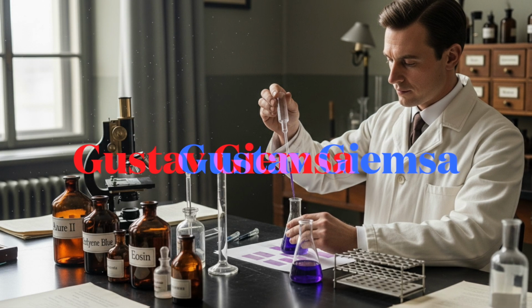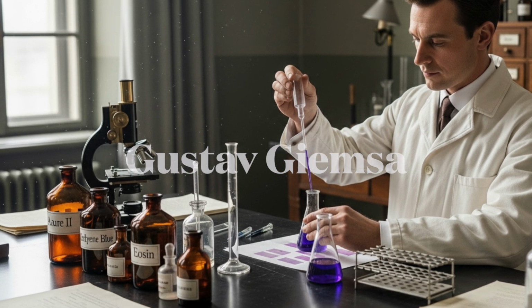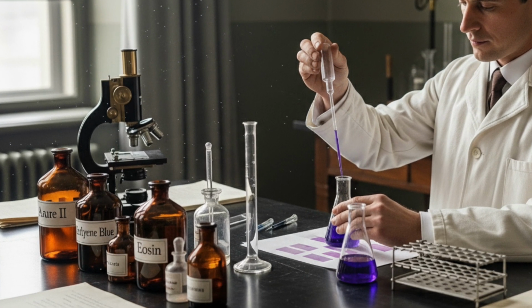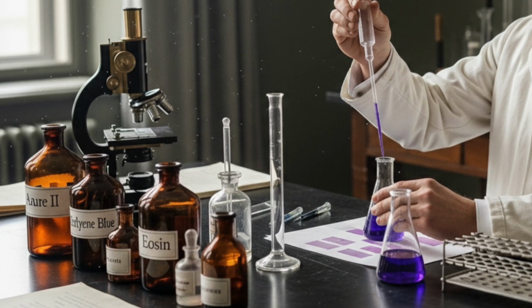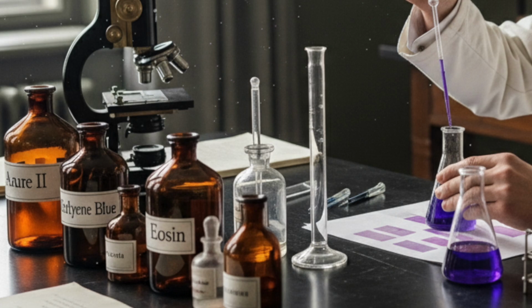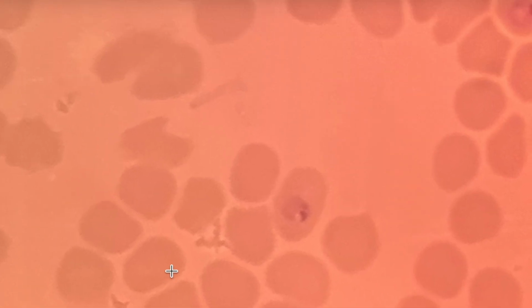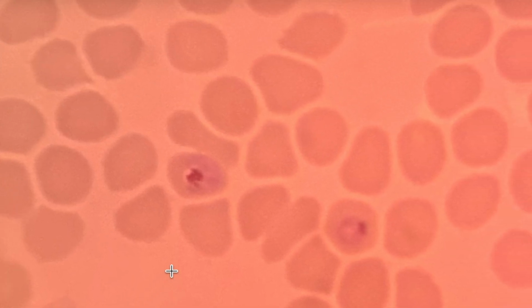By 1904, Gustav Giemsa, working at the Institute for Tropical Disease in Hamburg, refined Romanowsky's method. He standardized oxidation of methylene blue, stabilized azure dye production, optimized dye ratio, so how much of each to use, and introduced glycerol and methanol for preservation. The result was a reproducible, stable stain suitable for tropical disease laboratories. This became known as Giemsa stain.